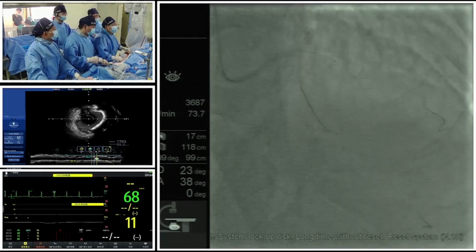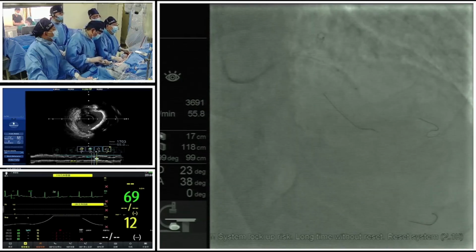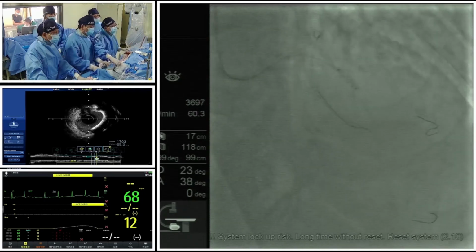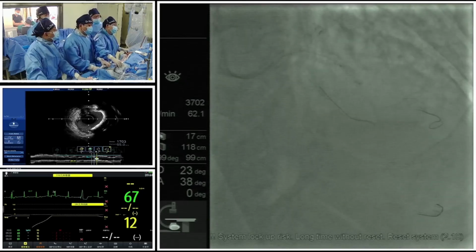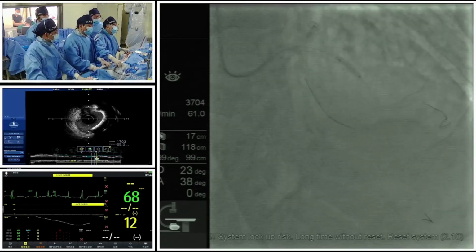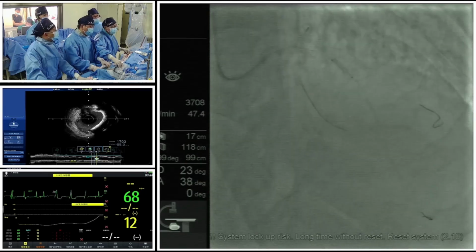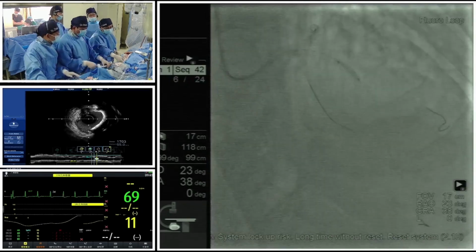You know, there's an interesting thing with the use of IVL. When we give the shock wave, from the ECG monitoring we could see some PVCs, premature ventricular contractions. Do you think that's a problem we should be worried about, or is it all right? It's just a phenomenon we may observe when we use IVL. I think it's relatively benign.